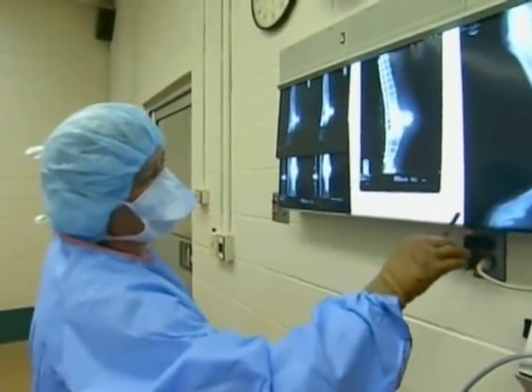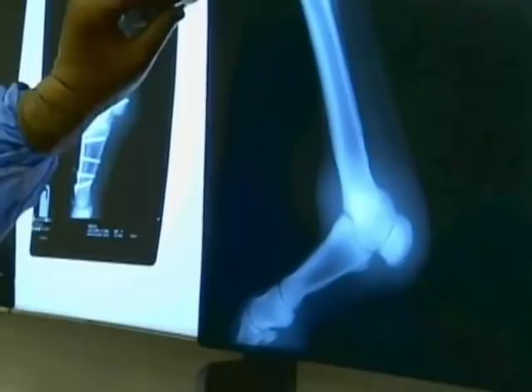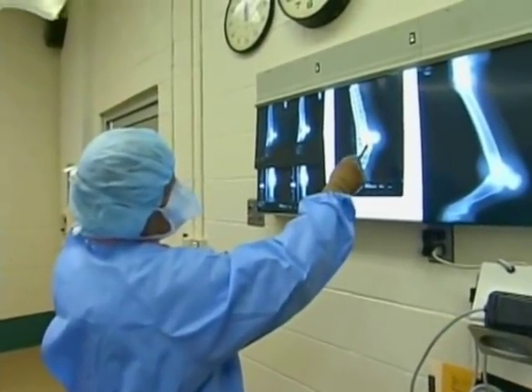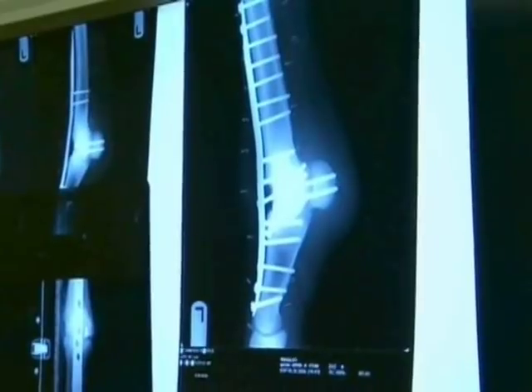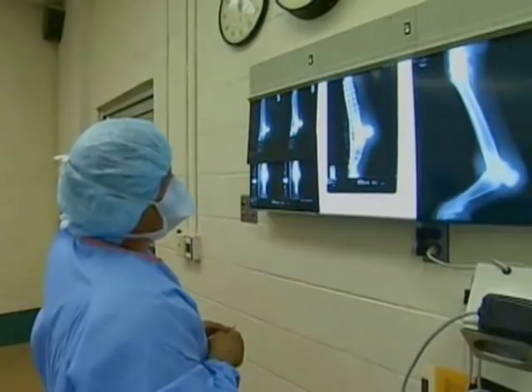The one on the right is the preoperative film, and our major problem was this angle to the fetlock. What we've done with the repair is we removed the cartilage from here to make this one bone, and then we've placed screws in — not just in the plate, but in strategic locations to set the joint essentially in what would be a relatively normal posture.